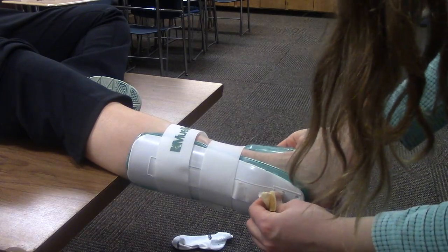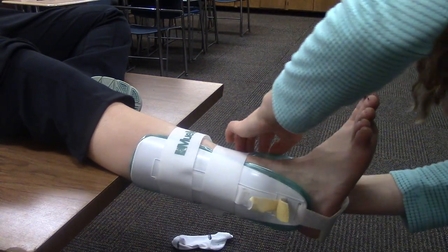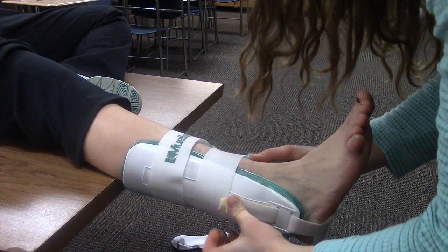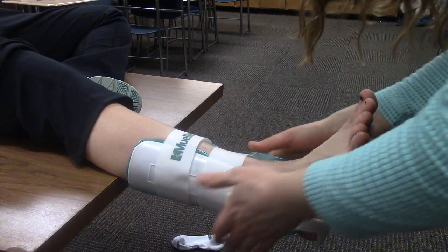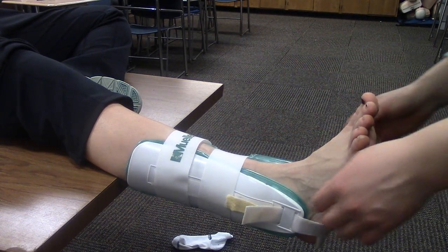I'm going to adjust this bottom heel part so it's nice and tight on her heel. Just making sure — is this feeling okay? And check for some circulation on your toes.